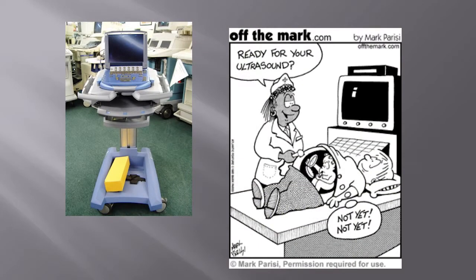All right, so one of the things you'll see, depending on where you work, is a different style of ultrasound machine. If you end up on the UH side of things, I load up all those ERs with Sonosite, so that would be the machine that you'd use. This is what a Sonosite looked like. This is actually the machine that I trained with when I was doing my fellowship.